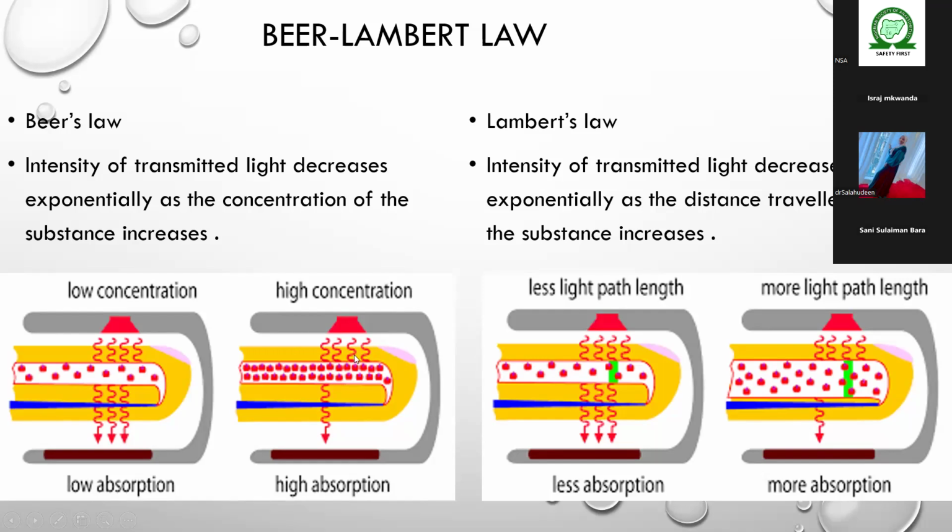in highly perfused patients. The little light that escapes to the photodiode is analyzed by the photodetector, which relates to the transducer microprocessor. They produce it as a ratio, a figure that we read as the SpO2. In low concentration, the reverse happens: less will be absorbed and more will escape to the photodiode, and the ratio will come out as low SpO2.